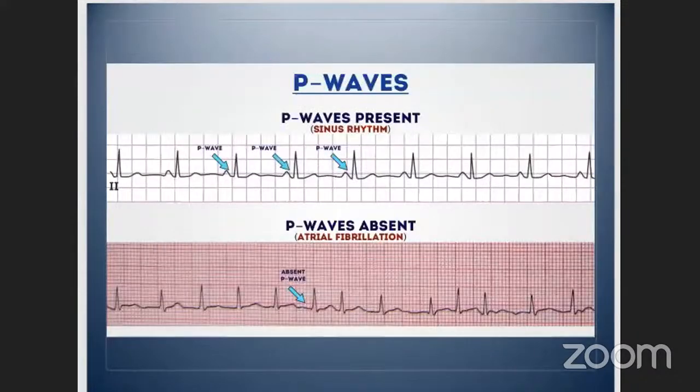So P waves, we mentioned rate, rhythm, axis, and then looking at our different waves. So P waves, we always want a normal amount of P, and a P must precede every QRS complex. So this would be a healthy ECG where we can see it nicely. We did have the Mobitz two, where we saw that there was so-called excess P, where there was more P than there were QRS complexes. And in atrial fibrillation, we can see that there are no discernible P waves here.